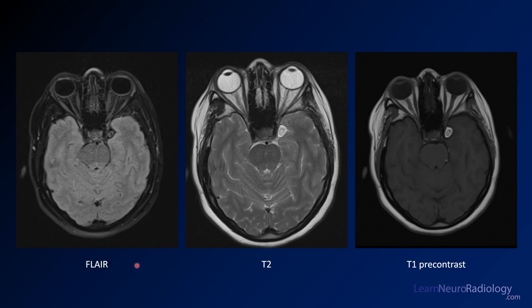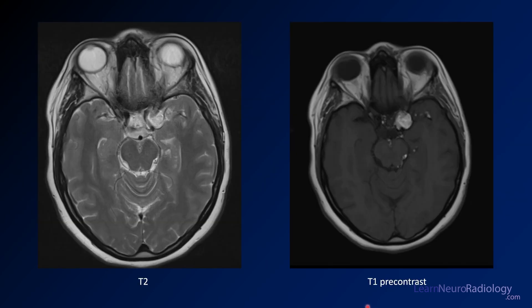Here we have our first images for this case. We have a FLAIR on the left, a T2 in the middle, and a T1 pre-contrast on the right. To make this a little easier, I've labeled the images for you. Here we have some more images — a close-up of that T2 and a close-up of that T1 pre-contrast.